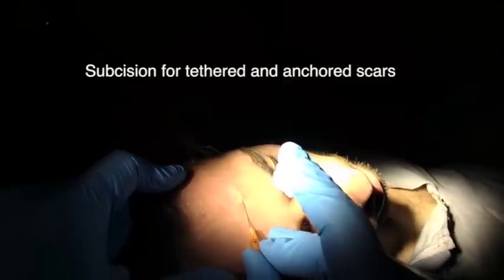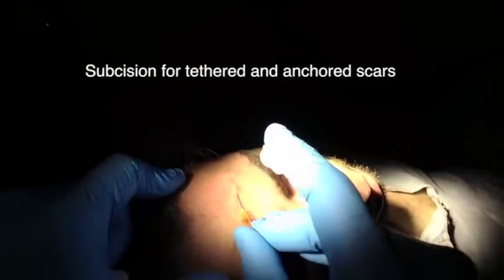This is just pure subcision on a scar on the forehead using a 25-gauge needle, and it works very well. The minimum subcision technique I perform is the original windscreen wiper technique from 1995. However, the other techniques I've shown may not be known by my peers — new papers are coming out and I've been doing this for years. That's why if I were to record all of this in my notes and I was audited, a lot of people would not follow what I do. I hope that explains why I write down the minimum of what I do; in the majority of cases you can see why I need regional nerve blocks and the extent of subcision I do in my patients.